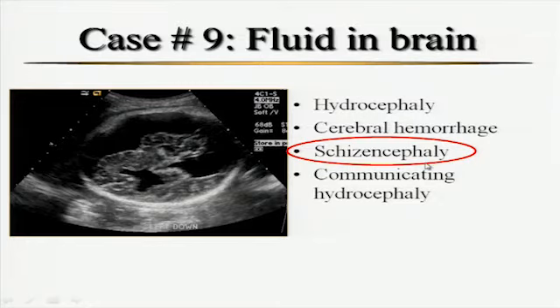So make sure that you're looking for the side that's closest to the transducer also. Roll the patient. If you've got a bed that goes Trendelenburg, put them in Trendelenburg. Let gravity pull that baby's head out of the pelvis so you can try to get it. Roll them around. You have to be able to see both sides of the cerebrum.